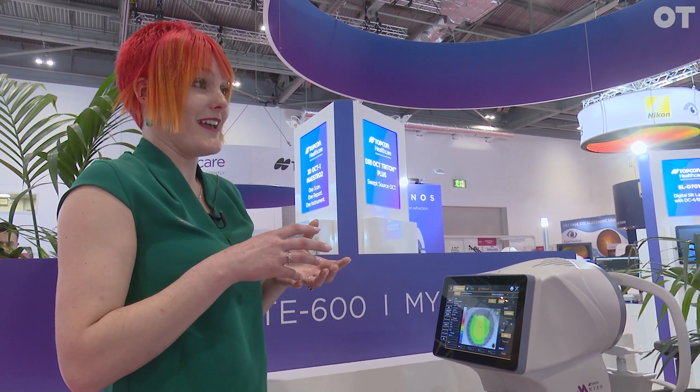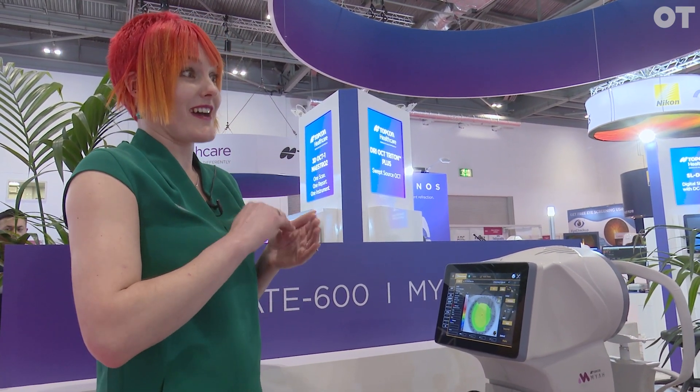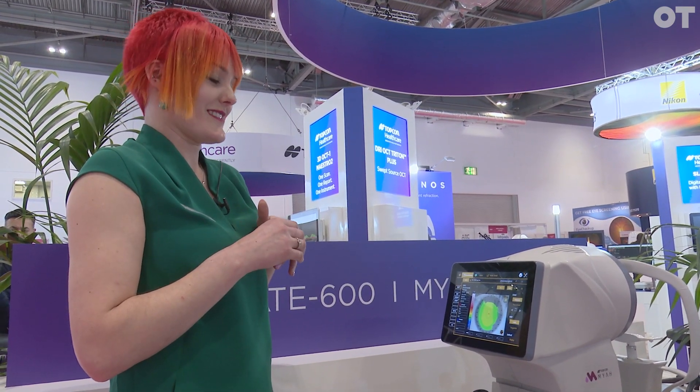We can also start to design lenses from here using that surface topography, and then monitor the patient's axial length and trends going forwards.